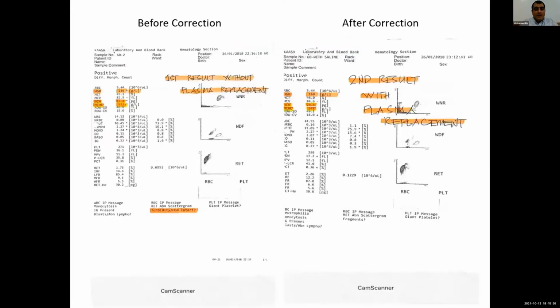from the last result. This is an example of one patient presented with hypertriglyceridemia. On the left side, we'll find falsely increased hemoglobin. Hemoglobin is 236 gram per liter, and the MCH is very high, and the MCHC is also very high. MCHC is 523 gram per liter, and this condition should be correctly diagnosed and managed. Down here in the report, we'll see the flag of the RBCs. This flag is turbidity or hemoglobin interference.